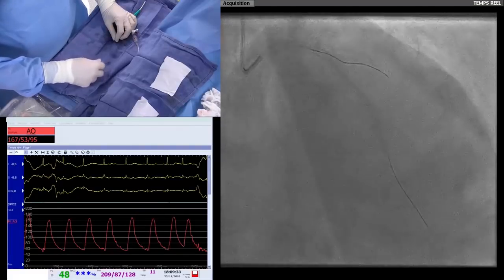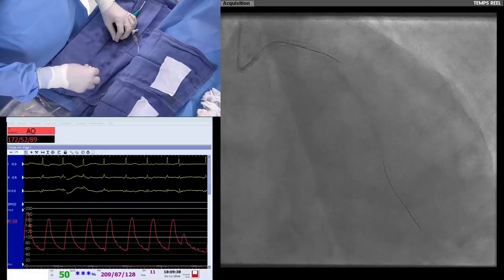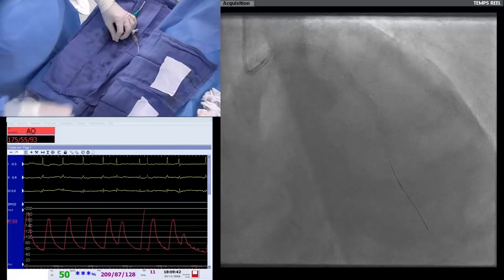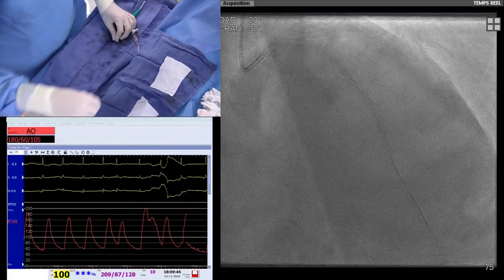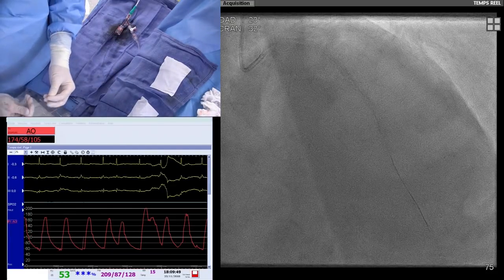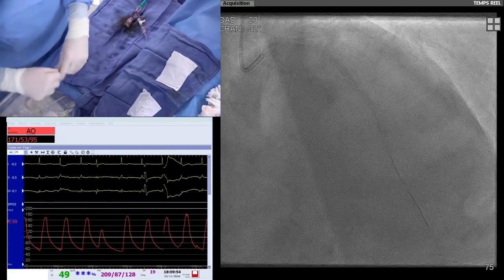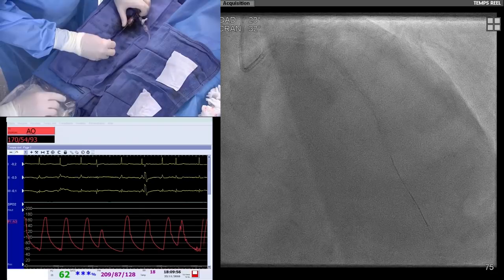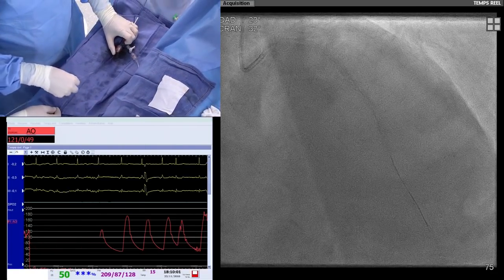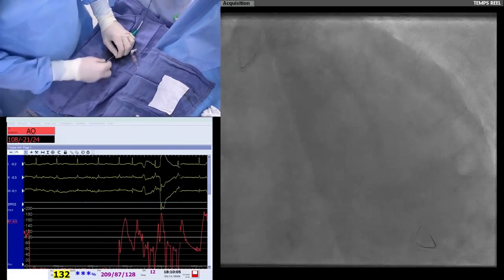So as you can see, I spin the wire just to remove it slowly, and thanks to that it avoids, I think, to engage the guiding and maybe induce longitudinal compression in the proximal part. That's very useful. Now it's time to perform a proximal optimization with a 5.0 balloon in the left main, and then we have to assess the circ, and we'll discuss if we have to open it or not.